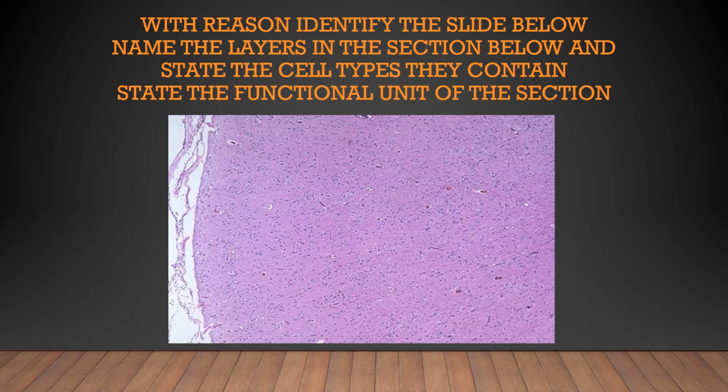This is the slide of the cerebral cortex. So it contains ill-defined zones, it's highly cellular, and there's also presence of meninges.